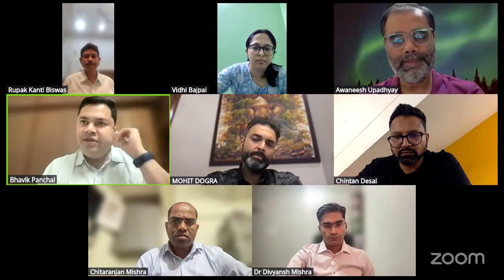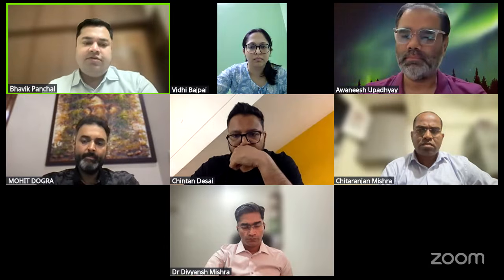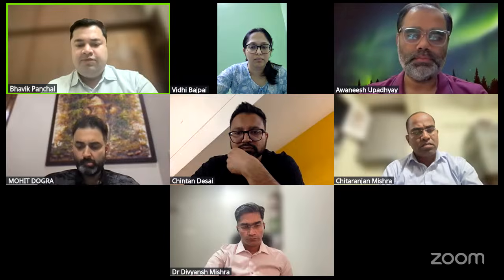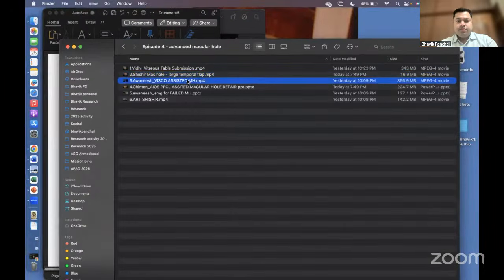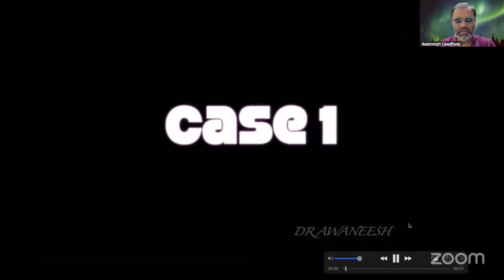And with this, we move on to the next segment, which is chapter 2 about usage of various techniques in terms of visco-assisted, PFCL-assisted. Once again, we start with a video, and this is by our very own Dr. Avnish, where he has performed a visco-assisted macular hole closure. I'll just share the video. Okay, over to you, Dr. Avnish. Can you lower the voice, please?